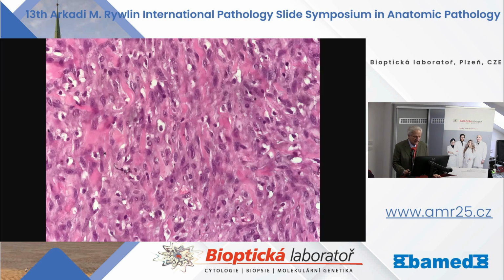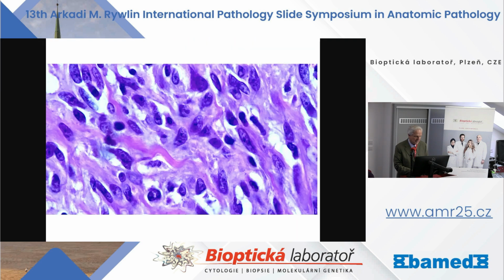Here in the other part, where the cells are more spindle, the nuclei are oval to round with indistinct nucleoli, and here you can see the high magnification.